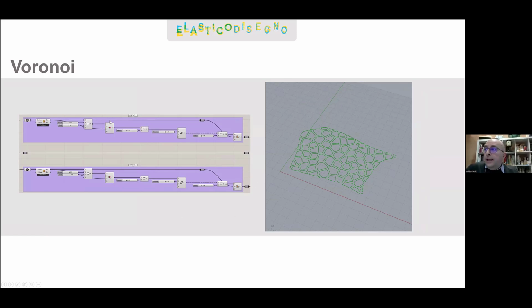Here, we created a bounding box, which was populated with random points, which are used to create a Voronoi pattern. The Voronoi pattern is like balloons starting from each point and inflating until they touch each other, and ends up with a lot of straight lines closing each single cell. So we rounded the corners of these cells and used an offset to create a bridge around each cell of about 2 millimeters.